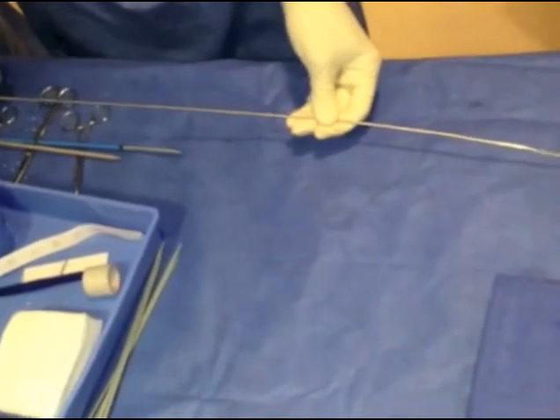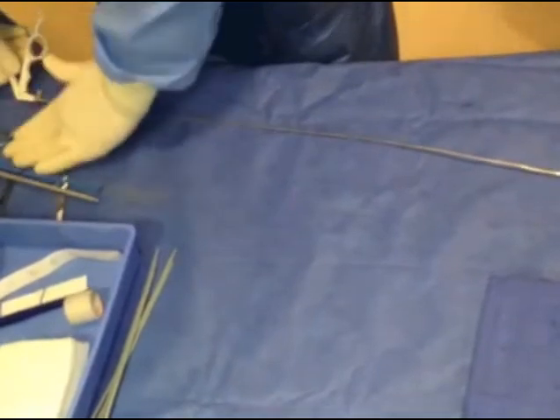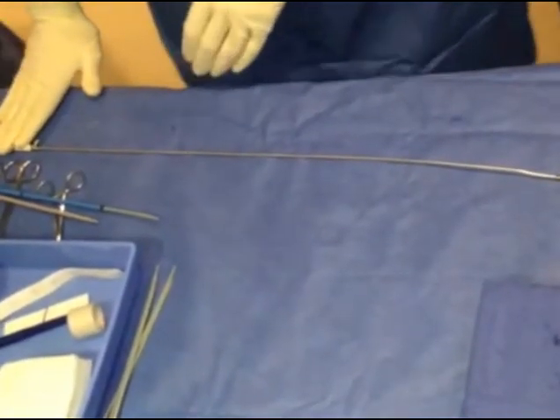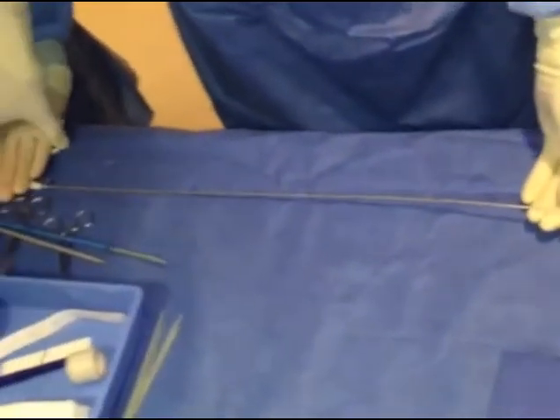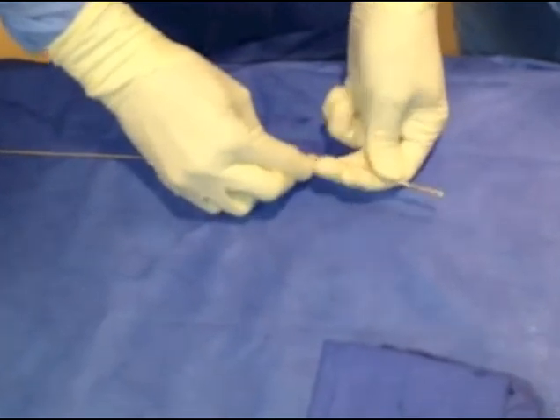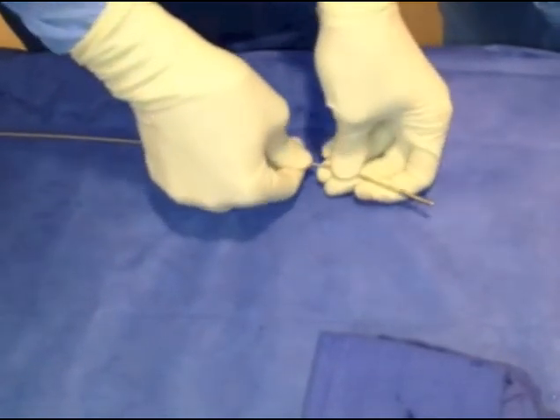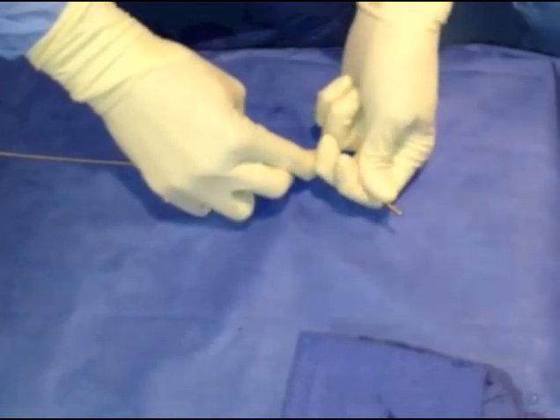The forceps arrive from the manufacturer straight and must be bent in order to allow manipulation and access to the tip of the filter. An assistant should hold the handle of the forceps while the tip is bent in roughly the same configuration as the access needle used for a TIPS. After this manipulation, the forceps should be checked to ensure that the jaw works properly.